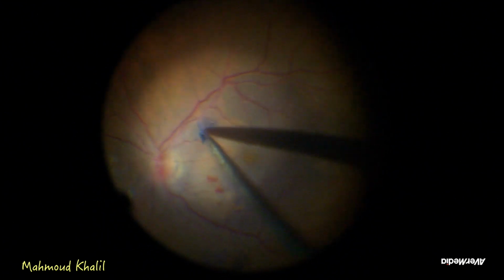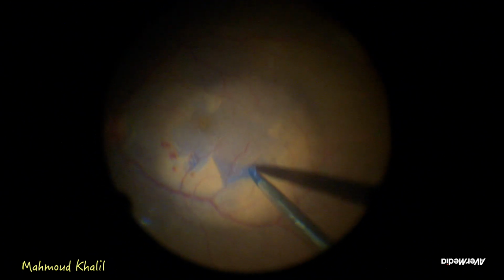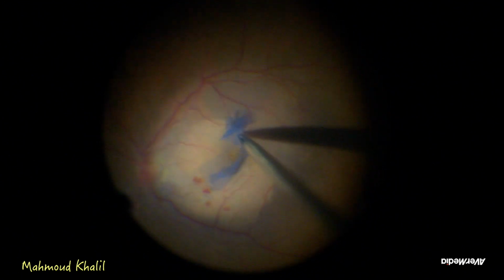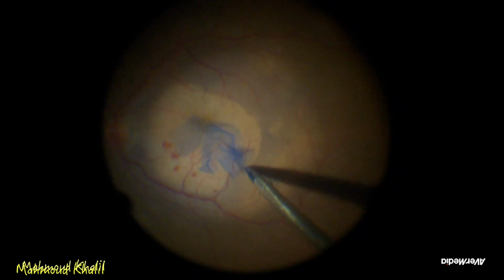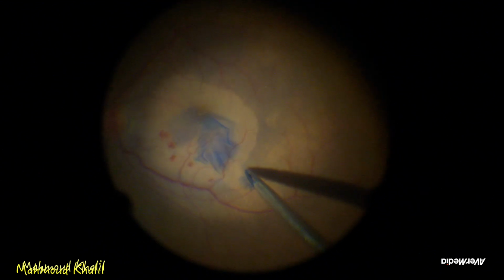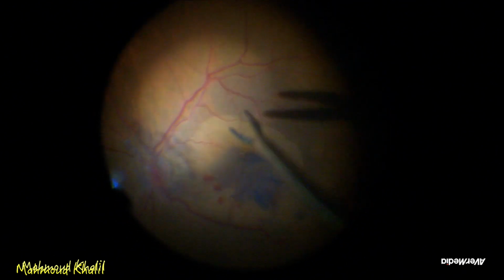The value of removal of ILM is to remove the scaffold for formation and recurrence of an epiretinal membrane postoperatively. In some cases, with OCT showing a large cyst below the center of the fovea, it is better to do what is called fovea sparing ILM peeling to avoid the roofing of the cyst and the conversion into a macular hole.